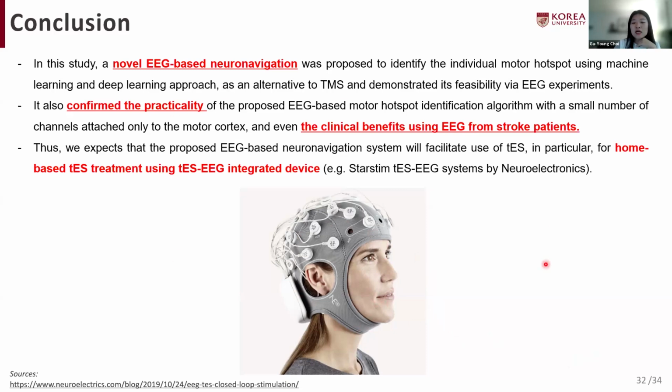In this respect, our proposed approach is anticipated to advance home-based motor rehabilitation through the application of TES techniques, improving accessibility and usability for individuals with limited mobility, thereby reducing the necessity for frequent hospital visits. From that, we expect that improved patient compliance and participation in rehabilitation would enhance neurorehabilitation outcomes.